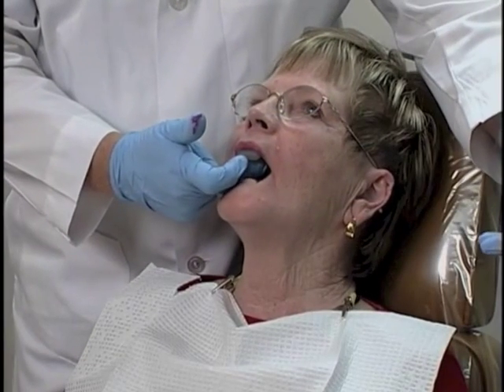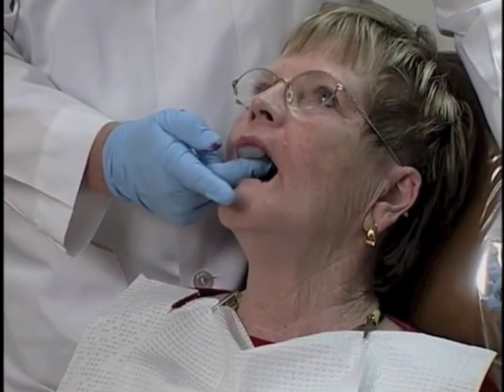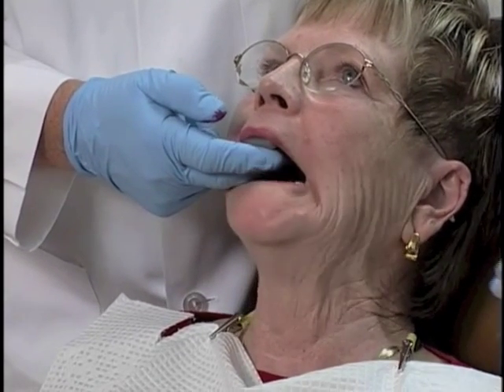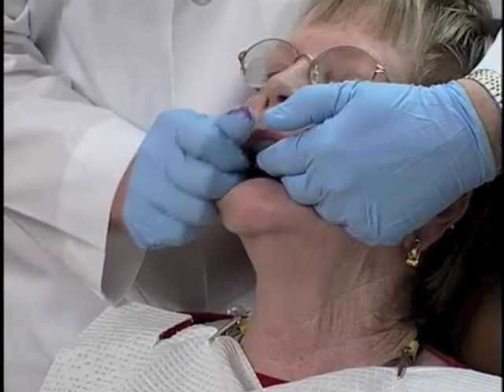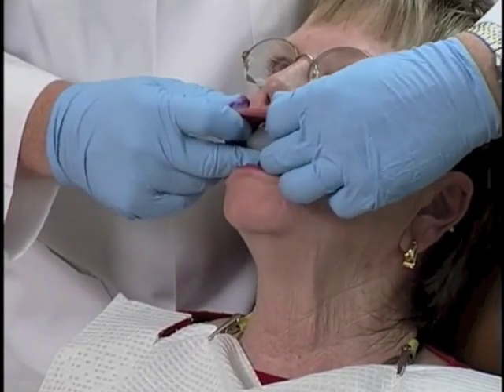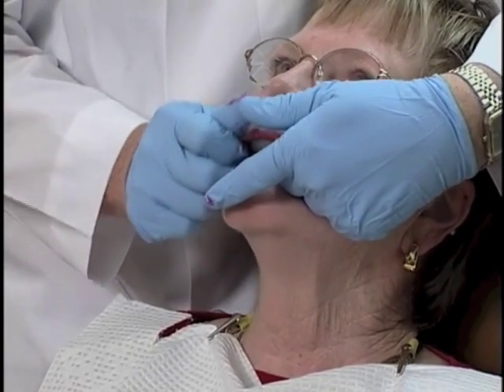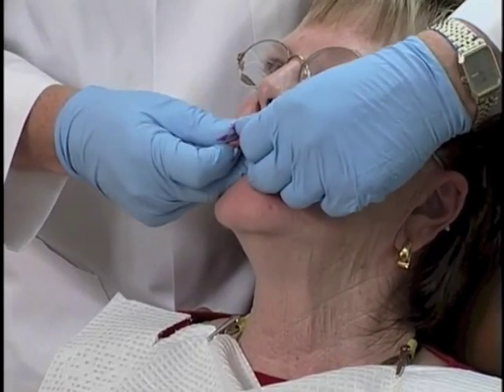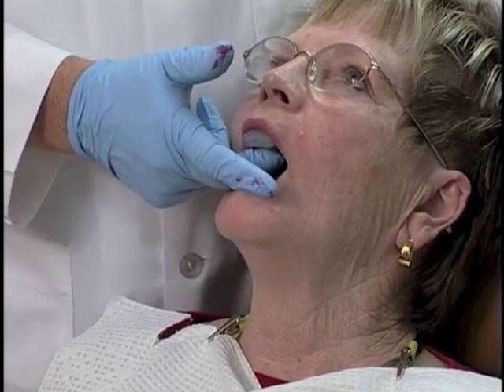Once the impression is seated, now we must go through all of the border molding procedures that we did with compound, which means we have the patient swing the chin from side to side, and then relax the lips, and then we border mold right and left buccal frenums like this, and for the labial we just pull it straight down. I usually do that in almost a continuous cycle through 2 or 3 cycles. And then the material by that point usually is set enough to where it is not going to move.